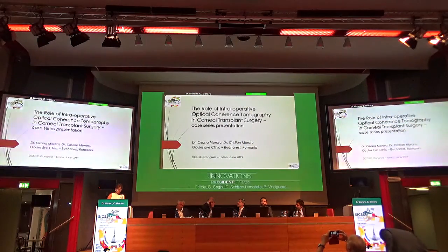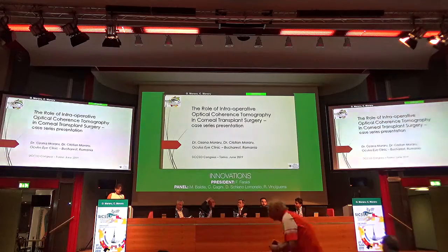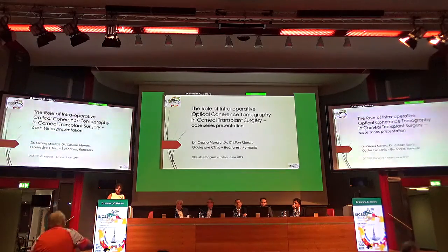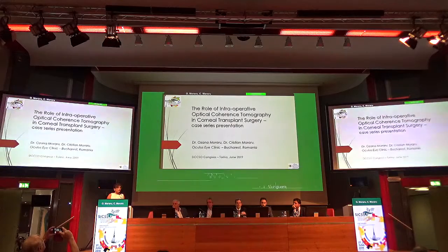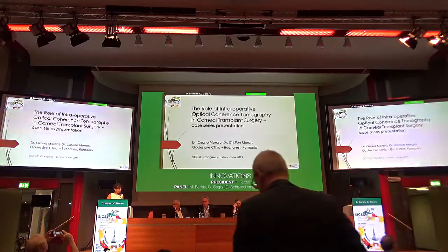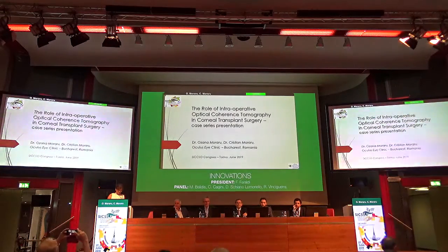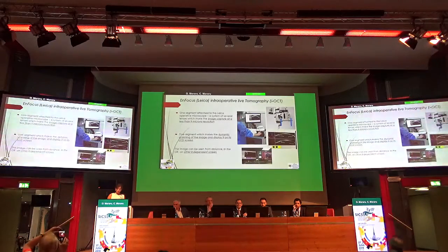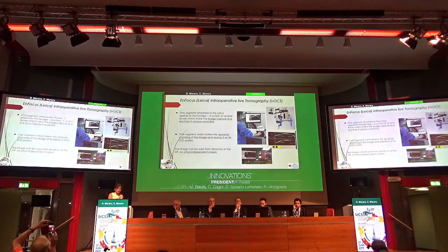I'm going to talk about the role of intraoperative optical coherence tomography in corneal transplant surgery, and our experience in the last 3 years since we have this machine. I have no financial interest. We use the Leica EnFocus intraoperative live tomography at Oculus Eye Clinic in Bucharest.